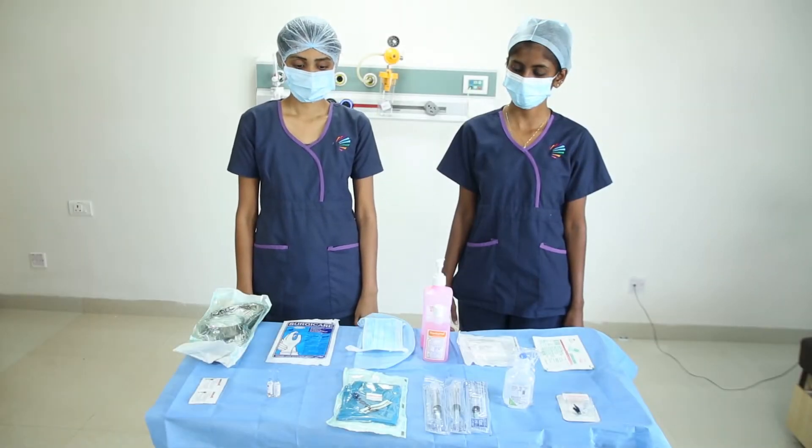In this session, we would learn how to access a chemo port line. Sister Diana and Sister Ann Lois will be demonstrating the procedure.